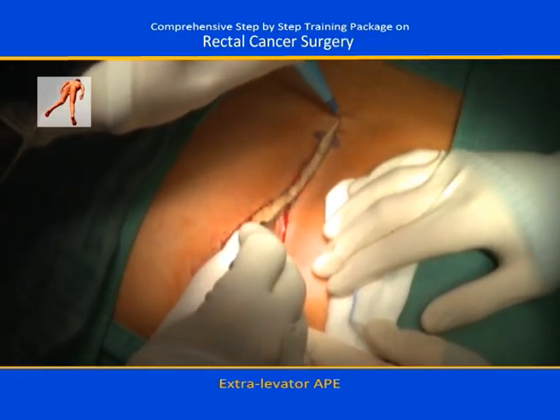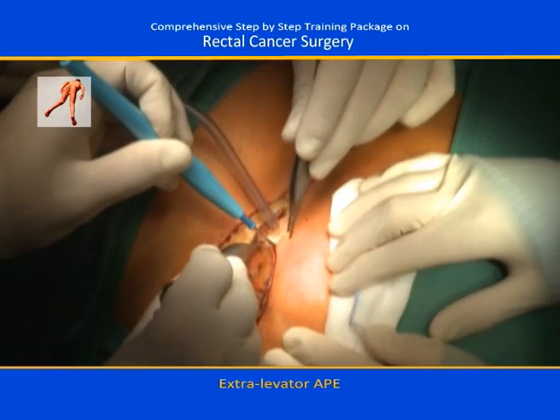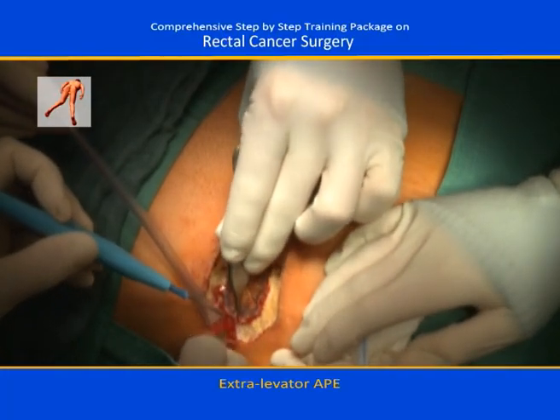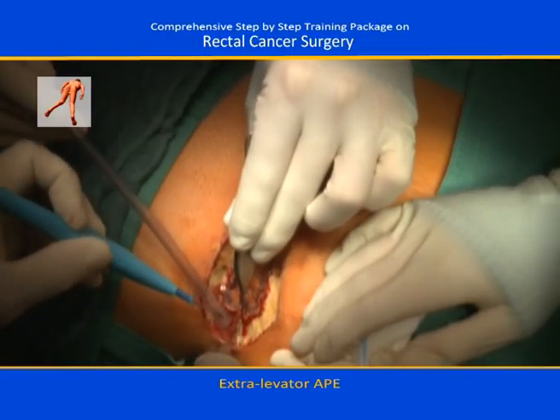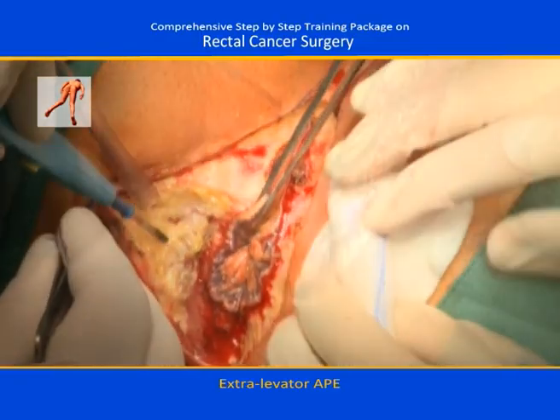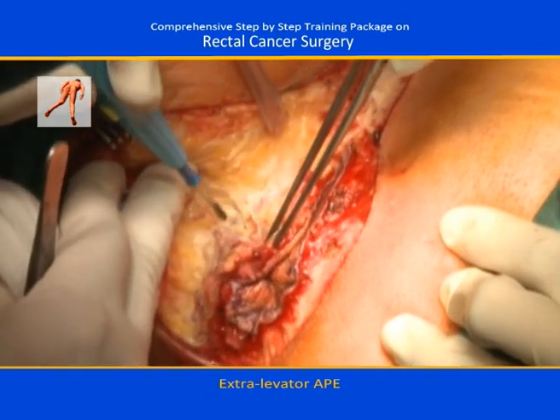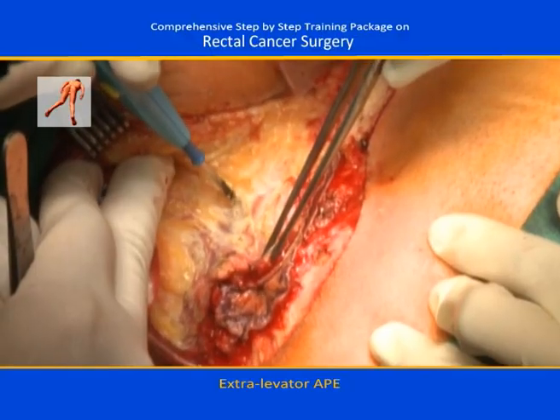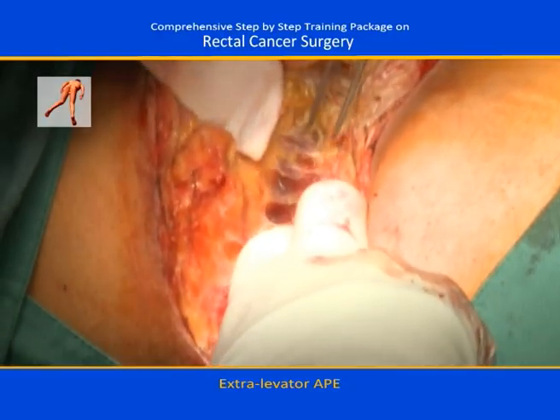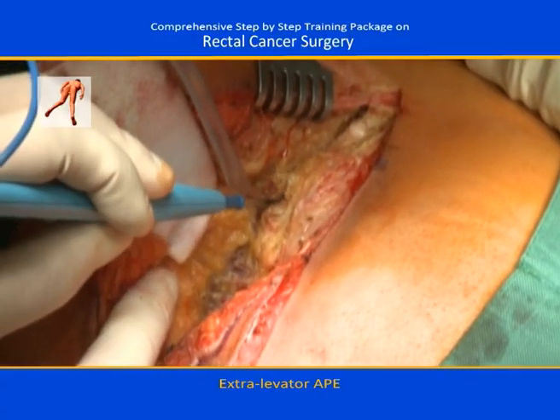The dissection is continued in the subcutaneous fat all around the anus, and once we have entered this plane, it's important to identify the subcutaneous portion of the external sphincter. You see, we follow the external sphincter along the ischioanal fat and the ischioanal fossa, and this is on the patient's left side. As you can see here, the levator muscle is going to the lateral of the coccyx and under or in front of the coccyx. Therefore, we remove the coccyx in these patients.